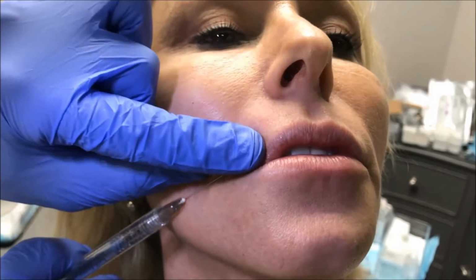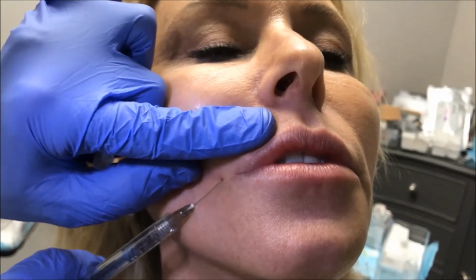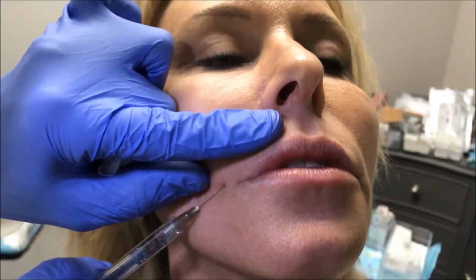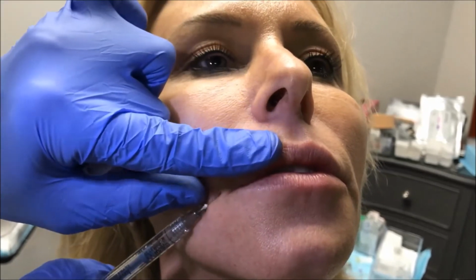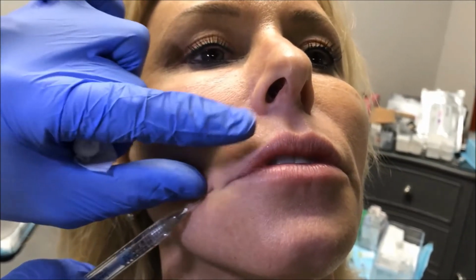Now I'm feeling the tip of my cannula. You can see it down there. And now I'm going to start injecting tiny bits of filler, antegrade. Antegrade injection using a micro cannula also serves as a means of hydrodissection where you kind of open the tissue in front of the tip of the cannula. Also makes it more comfortable for people.